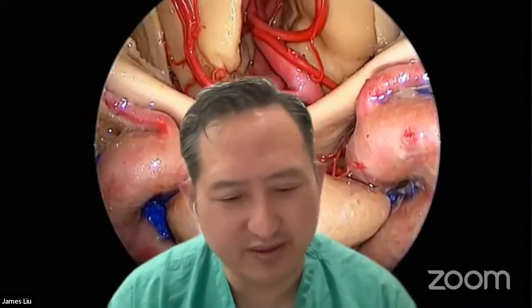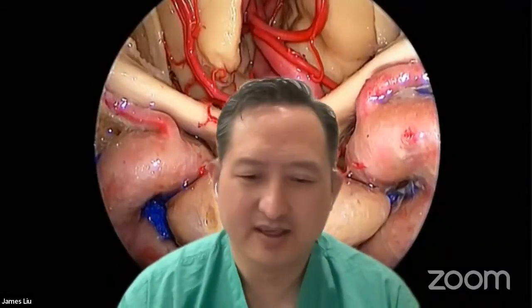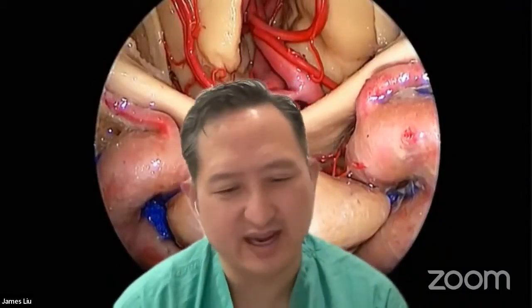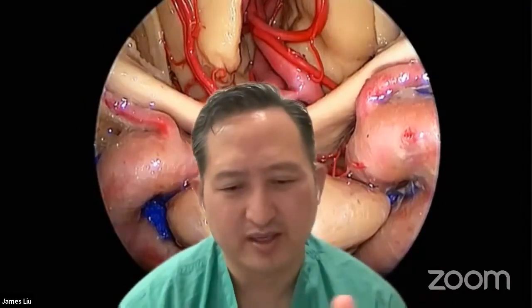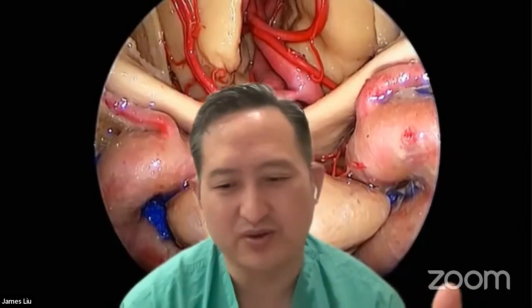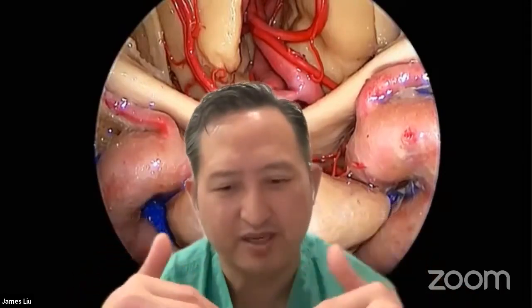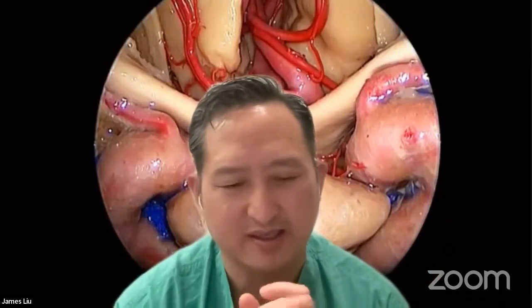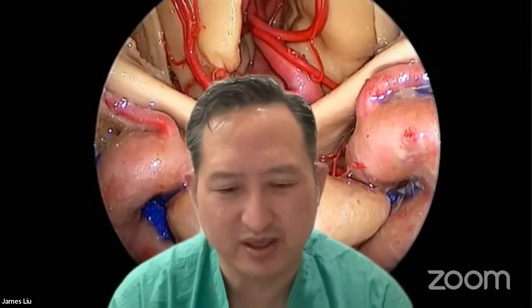Yeah, thank you for those excellent comments. I agree with you in terms of my thought process and stepwise removal. I start the tumor removal at 6 o'clock, as you mentioned. After removing the 6 o'clock component, we go lateral and define the medial walls of the cavernous sinus. As you gradually remove the inferior component, the top portion will slowly drop down due to pulsations of the CSF. There are many tricks to get the top portion to come down.